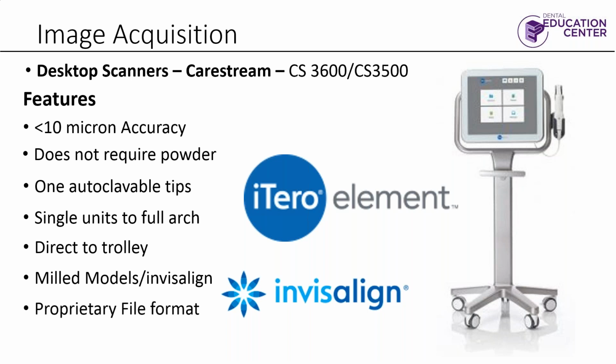The proprietary file format, it depends what system you have. It is opened. They have opened it to mills. It's a little tricky to get out, but you can.